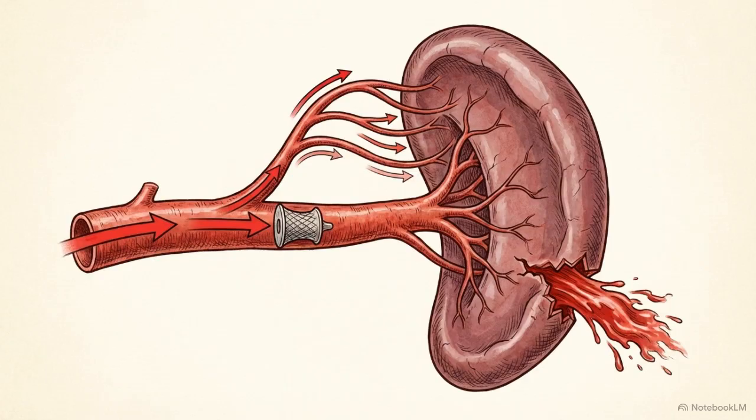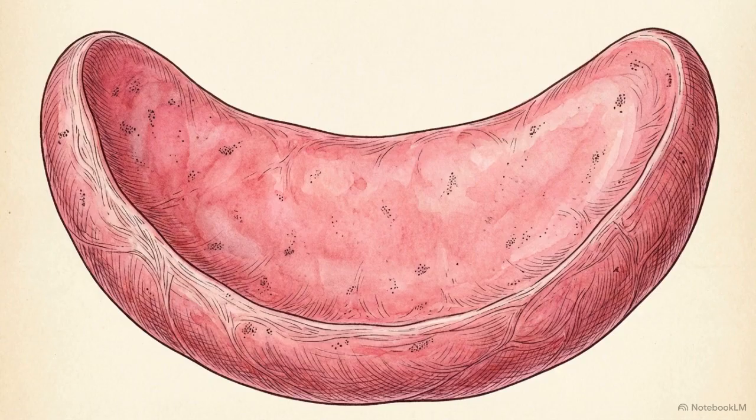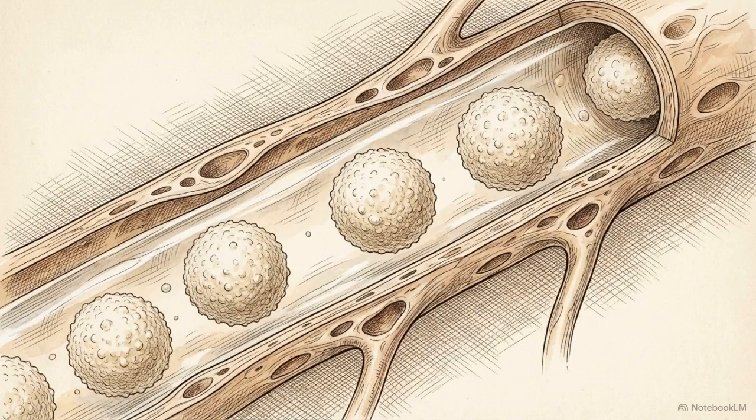The short gastric arteries maintain enough trickling blood flow to keep the spleen alive, but the overall perfusion pressure drops. The slowed blood naturally clots at the bleeding sites. By reducing the pressure rather than eliminating the flow, a large portion of the spleen remains highly functional. This preserves the patient's immune system, typically sparing them from needing post-embolization vaccinations.